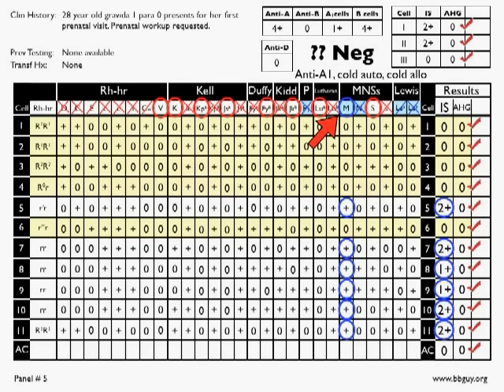You would handle this in exactly the same way you handled some of the other cases in terms of seeing what the best fit is. If necessary, you probably would do phenotyping. If necessary, doing select cells, et cetera. But my point here was to show that this is an anti-M, which brings us back to the ABO discrepancy.